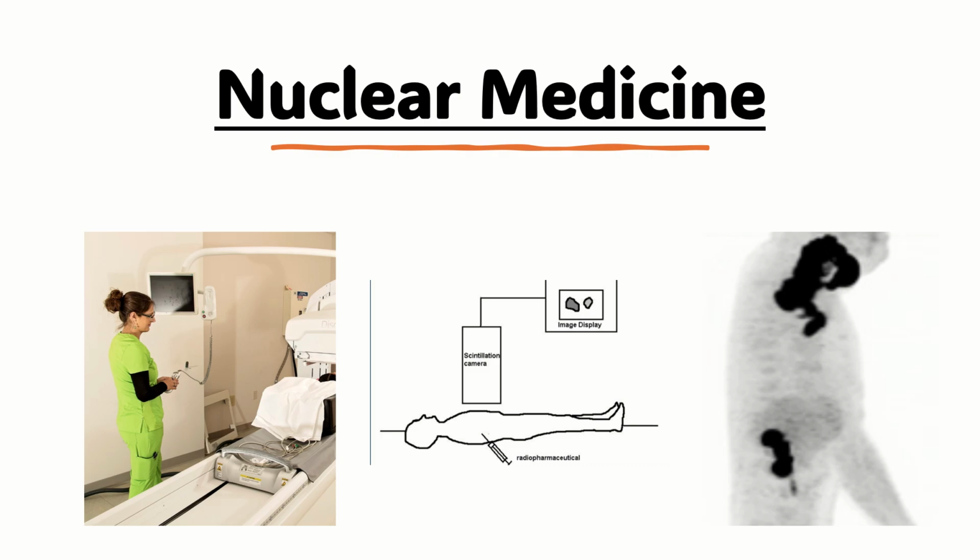An example of when nuclear medicine imaging would be used would be, say a patient is suspected of having intestinal bleeding. A sample of their own red blood cells could be radio-labeled, re-injected, and then traced using a scan. The areas of high radioactivity point directly to the bleeding site.